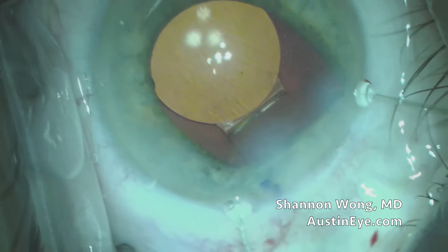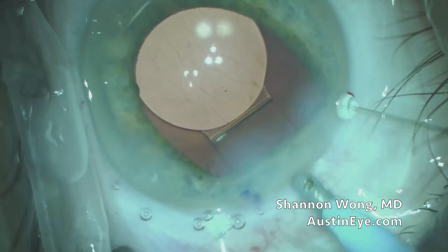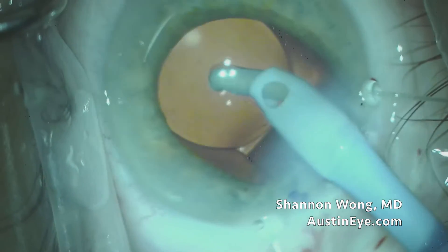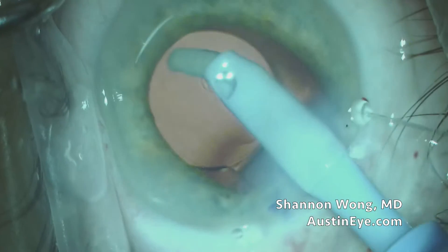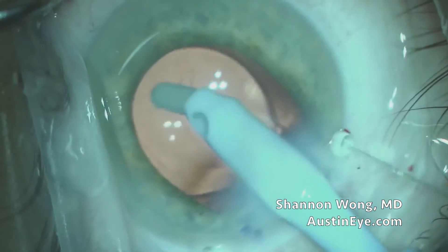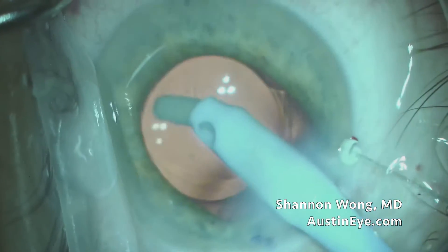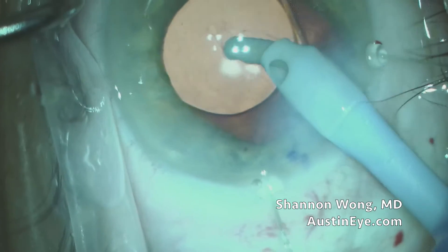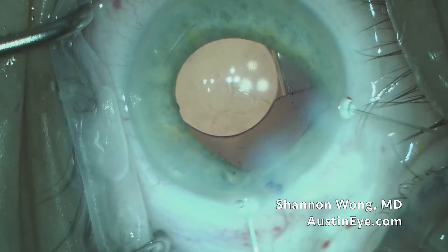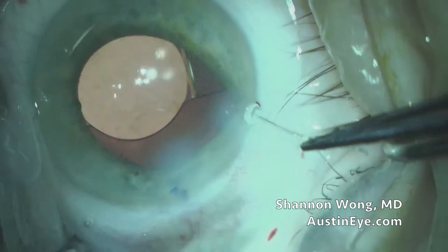You can see the opening in the posterior capsule remains stable. The moment of truth is when we go in with our irrigation and aspiration instrument and try to rotate this lens. Once we've rotated it 90 degrees, we pretty much know this lens is in the bag, and therefore we can remove the iris retractors.